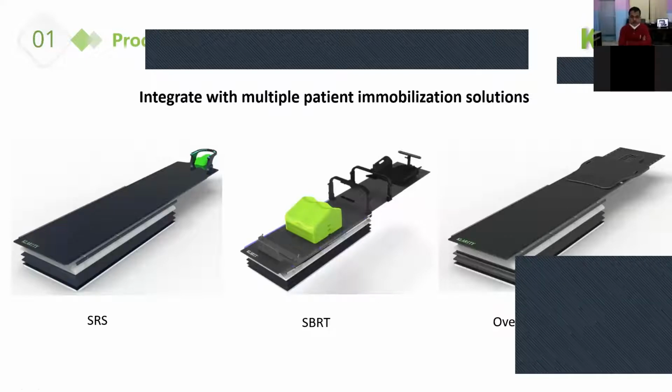Our product also integrates with multiple patient immobilization solutions. This includes SRS solution, SBRT, and also Klarity overlay base plate.